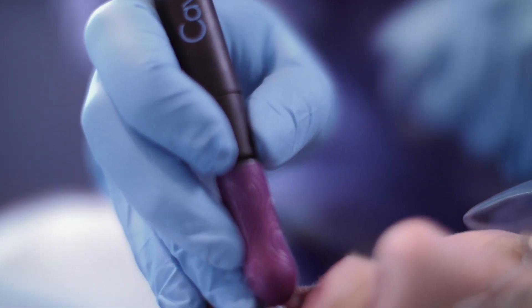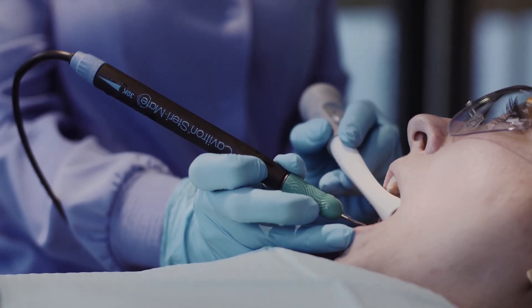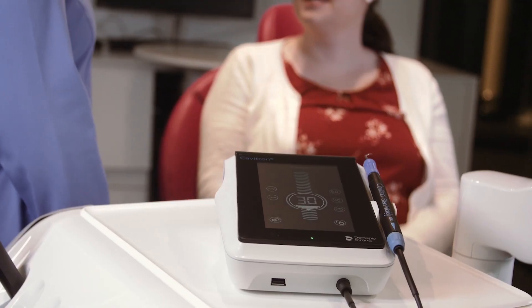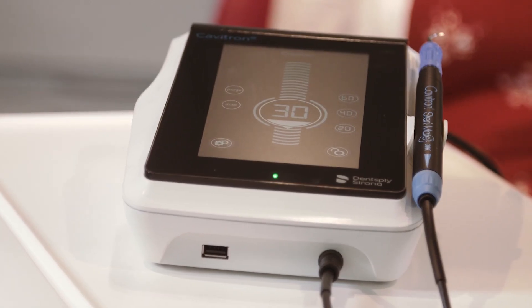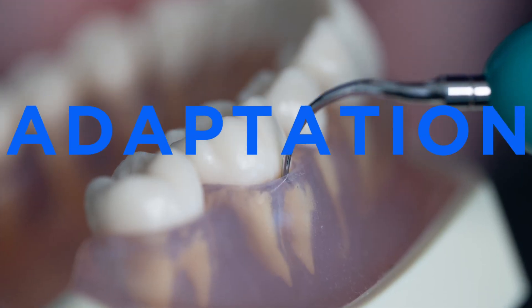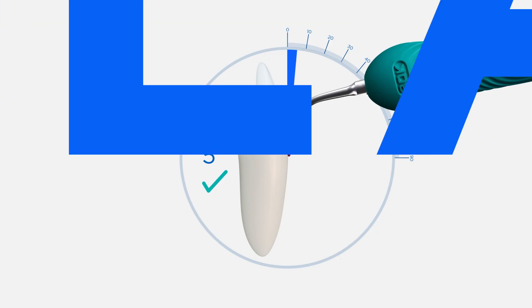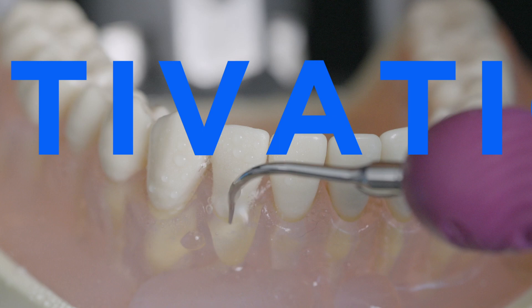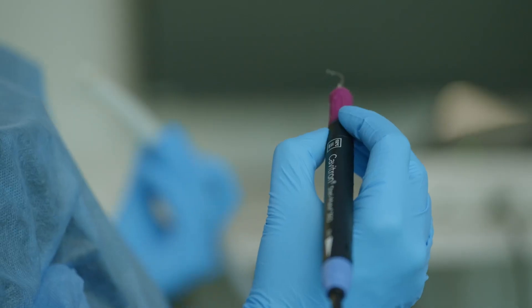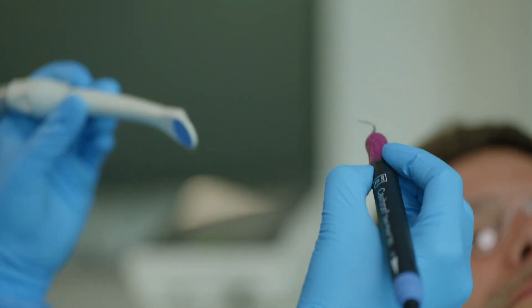Maximizing the benefits of ultrasonic instrumentation involves implementing proper techniques. The three A's of ultrasonic instrumentation are adaptation, angulation, and activation, and proper execution of each may enhance effectiveness and efficiency.